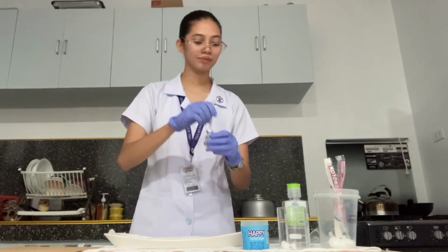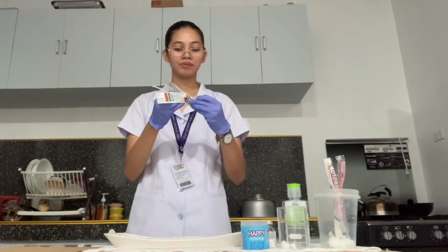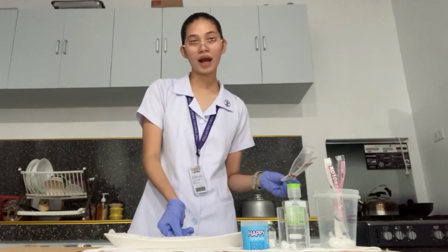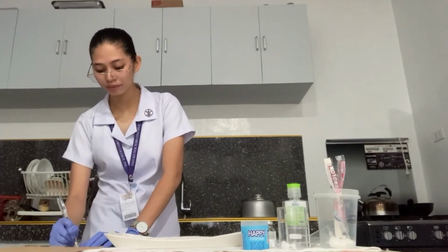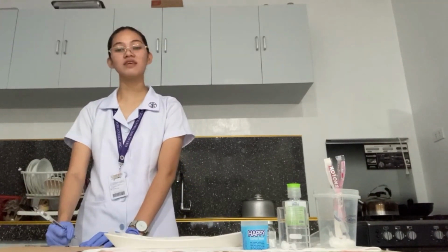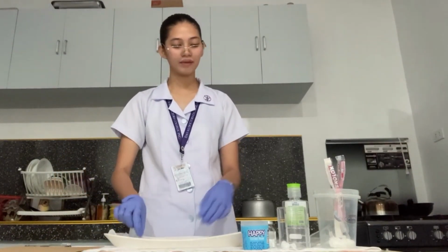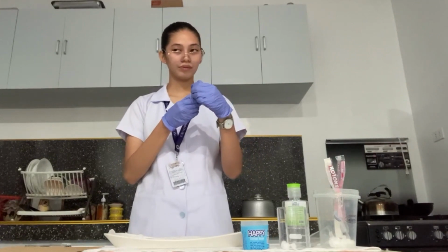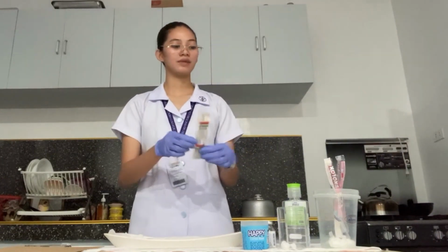After that, we're going to recap our syringe and then place it into our hypodermic tray. Again, writing the medication ticket with the name of the medication, the name of the patient receiving the medication, the dosage, and the time to be administered. Then we're going to place it along with our syringe to the hypodermic tray. Then we're going to dispose our wrapper to our waste receptacle.